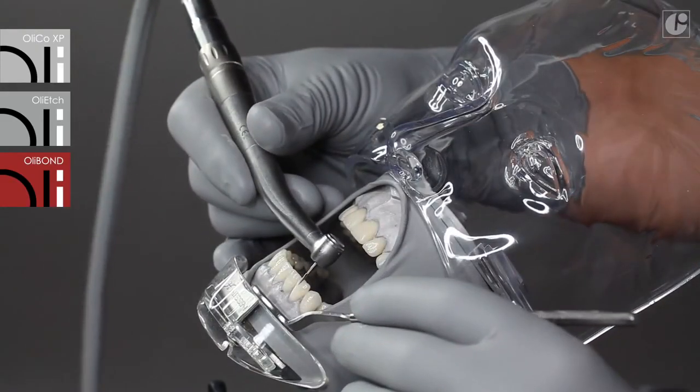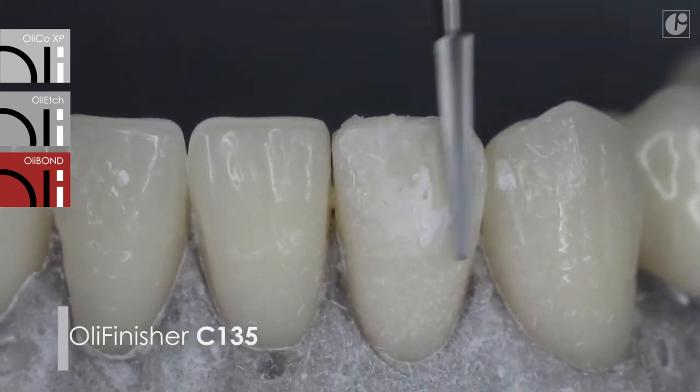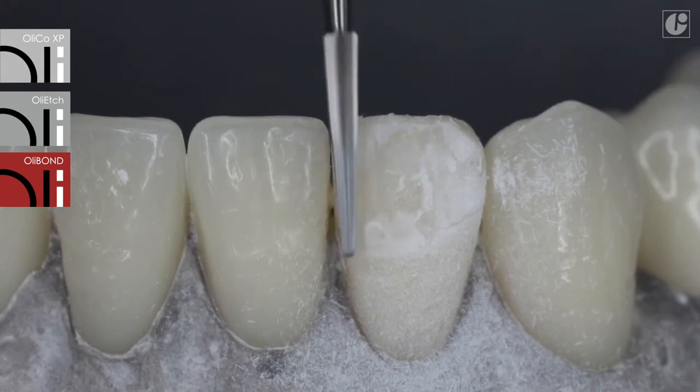Finishing instruments have been specially designed for work with composite materials. They do not overheat the filling and maintain its aesthetics and durability. Properly profiled blades collect or smooth out the composite material and glide over natural tissues.